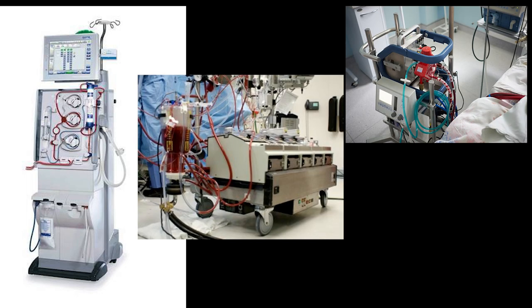These types of flow sensors can be found on some dialysis units, rapid infusers, ECMO pumps, and heart-lung machines.